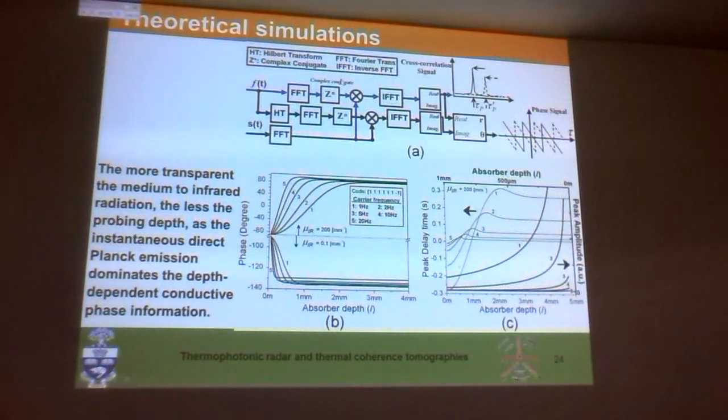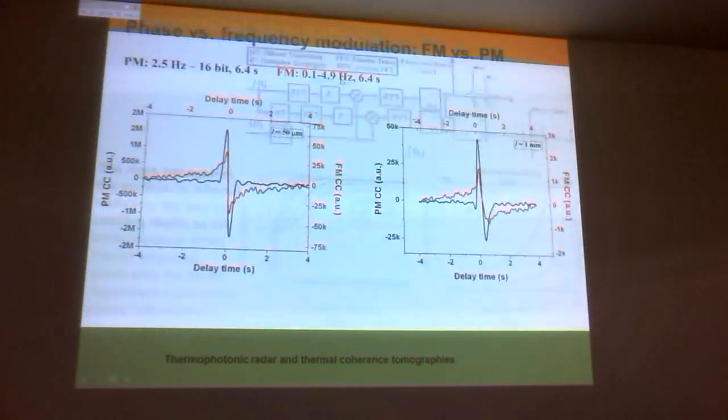So something like a bone or a tooth is just right because there are some optical windows, but all in all, there is an opaque medium there. So conduction heat transfer has a chance to come out and give me the image that I want.